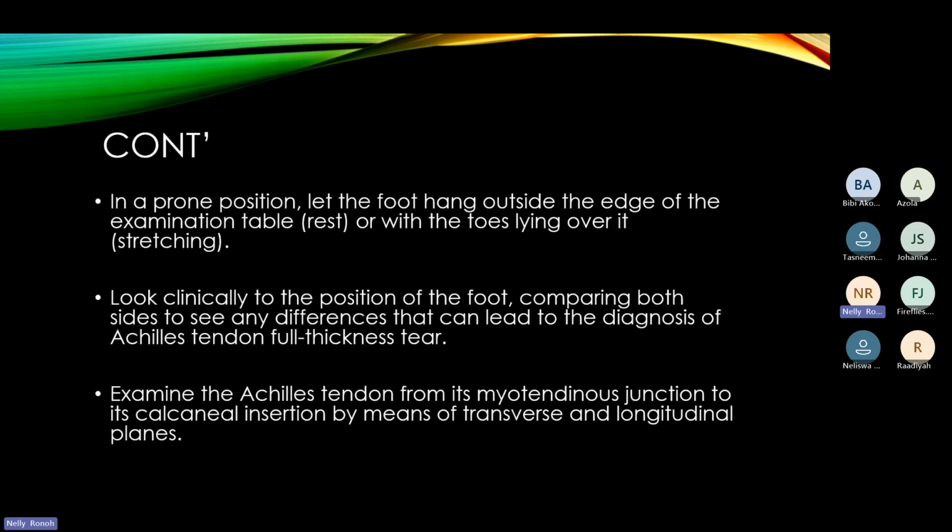So then we have, in a prone position, let the foot hang outside the edge of the examination table, or with the toes lying over it, that is stretching. And look clinically at the position of the foot, comparing both sides, because in most cases, when there is an Achilles tear, you'll be able to see the difference between the other one.